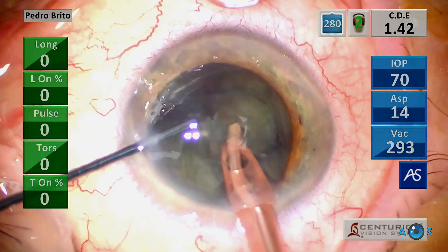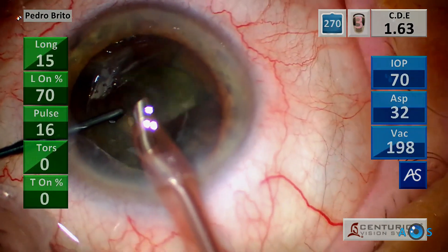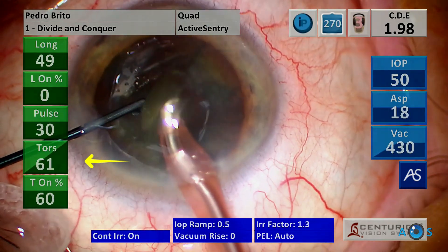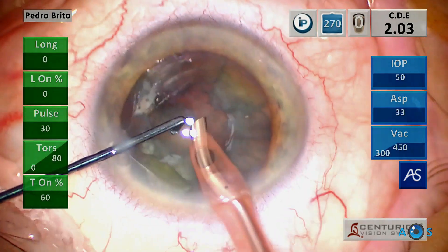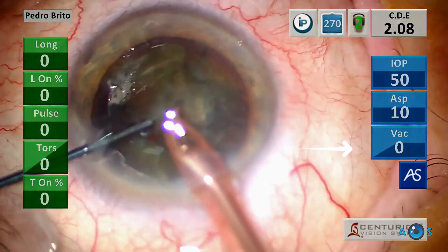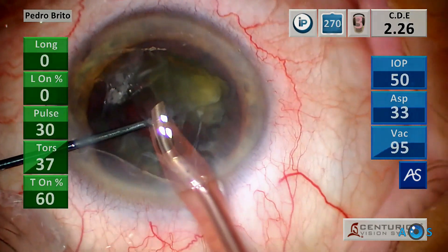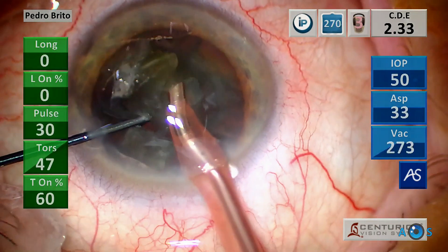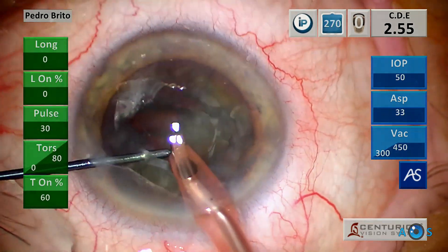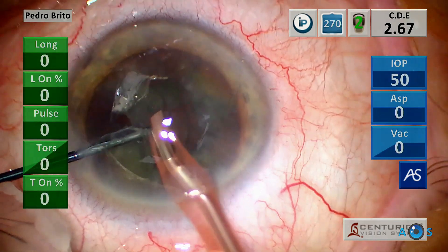The nucleus has now been segmented into four quadrants, so emulsification will be easy and controlled. The program is switched to quadrant mode, which uses only torsional ultrasound energy in a pulsed mode with 60% duty cycle. For fluidics, vacuum is set to linear control in a tight range between 300 and 450 mmHg, aspiration is set to fixed 33 cc per minute, and IOP is again lowered to 50.